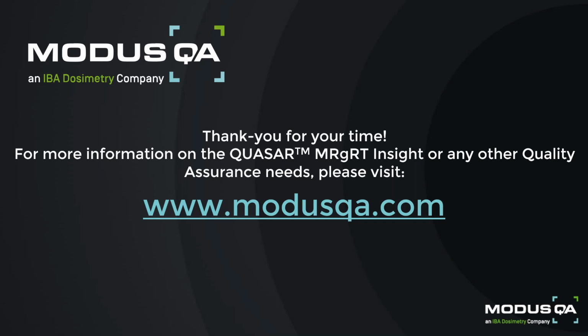There's no commitment to needing to utilize every single test feature or accessory that comes with it or that you've purchased. In fact, our team is in the process of designing an even easier and more cost-effective version of the Insight Phantom. It will include a simpler height adjustment indexing base plate, and you can use that for just axial imaging only. That might be of interest for customers such as yourself who want an even simpler and more straightforward workflow and only require the axial imaging portion.